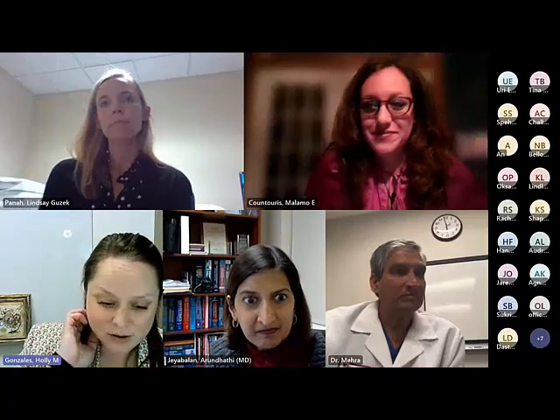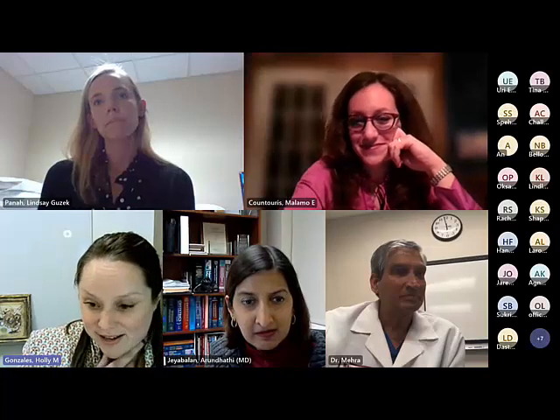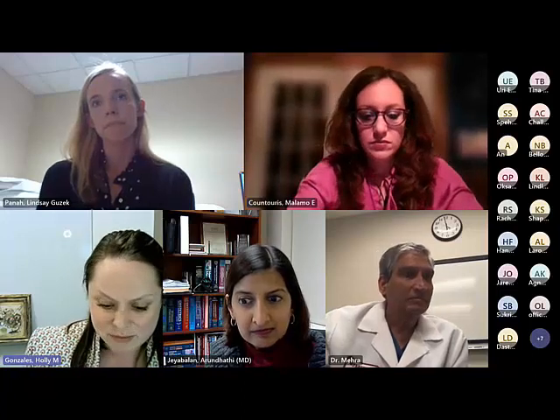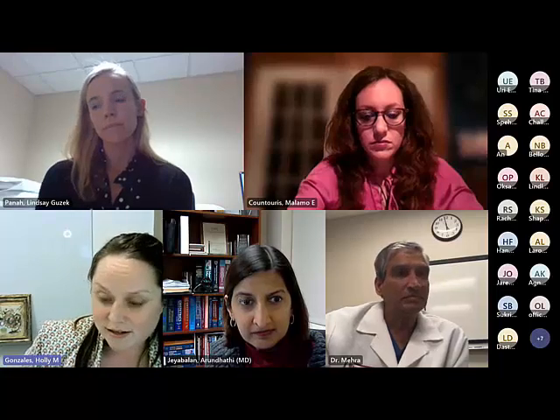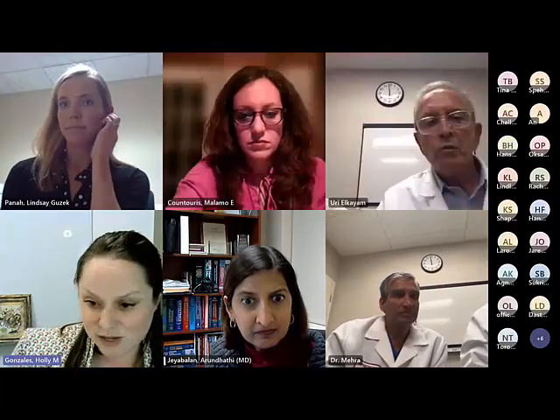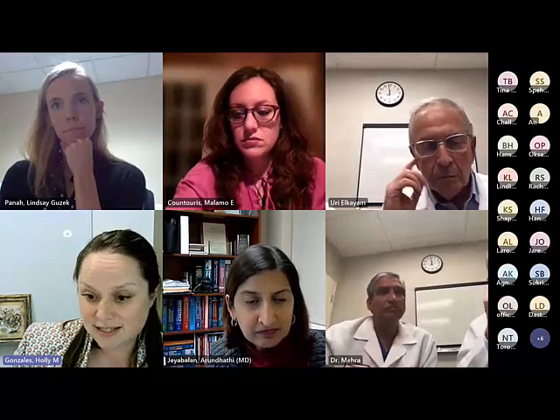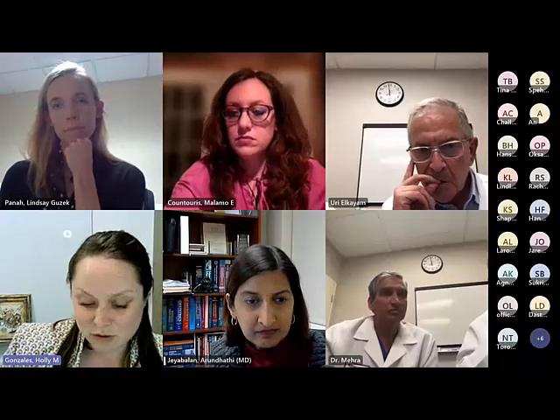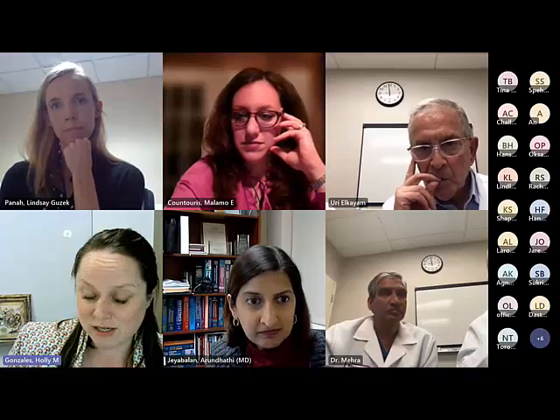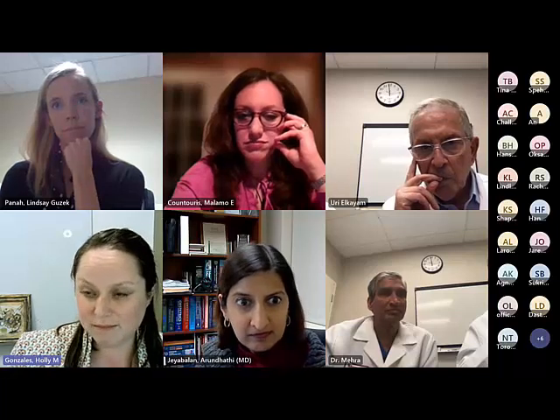Yeah, I agree. I happen to have seen the CT scan of this patient, where the raphe is highly calcified from base to tip, in addition to the non-coronary cusp. So lots of calcium on that valve. If you have the luxury of a CT scan, which I would recommend, you can minimize radiation by doing a gated CT in only the systolic phase, so very low radiation. Then you have the option of balloon valvuloplasty and a bailout TAVR if needed. Either way, it's nice to have the options, and CT really helps guide that.